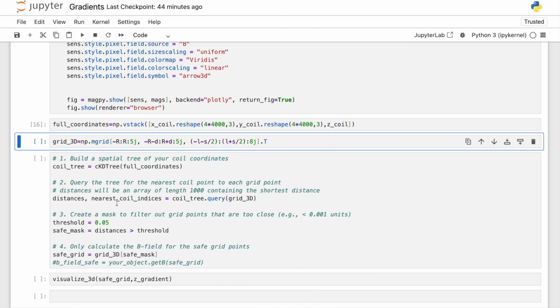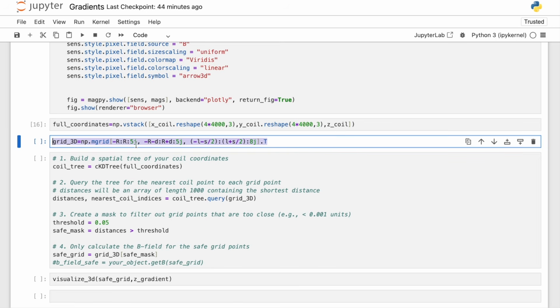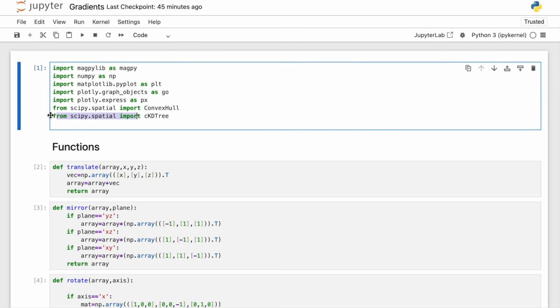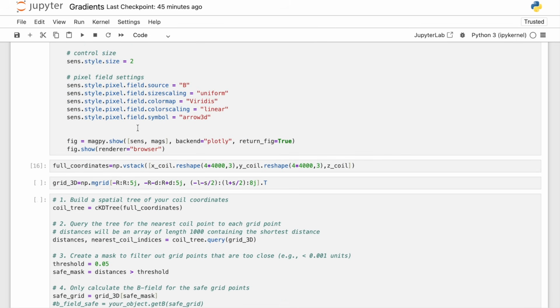Why I am doing this step is that when I define my 3D grid where I will calculate my magnetic field, there is a possibility of some small error which occurs when the grid point is really close to the current carrying coil. In that case, because the magnetic field strength is proportional to the inverse of the distance squared, and when the distance is less than 1, the distance squared increases the field value, and we can reach a singularity if we are really close. That's why we will make a threshold here and create a safe mask, let's say, or safe grid, which will ensure that we don't get too close to the coils and our visualization is correct. For this I used SciPy, which was imported here. For more information you can check out SciPy, which is a scientific Python library. So let's run them as well.